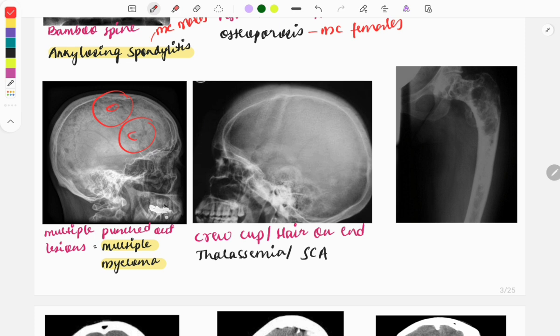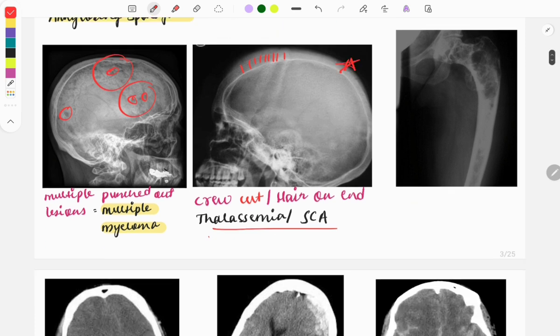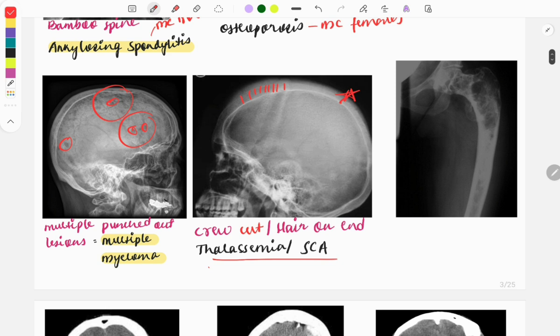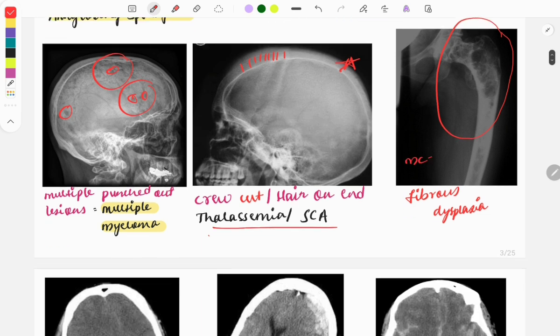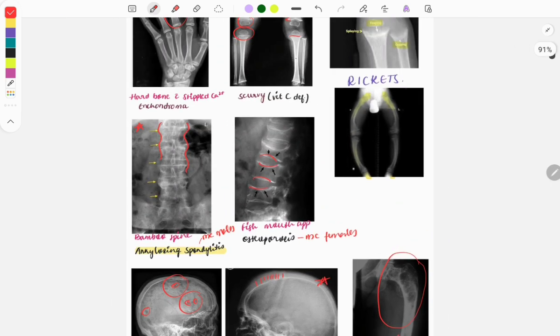Certain skull findings are seen in systemic diseases. In multiple myeloma you can see multiple punched-out lesions. In the next image you can see multiple spicules called crew cut or hair-on-end appearance, seen in hemolytic disorders like thalassemia or sickle cell anemia — a repeatedly asked image. The next image shows fibrous dysplasia with a shepherd's crook deformity; the most common site is the femoral neck.